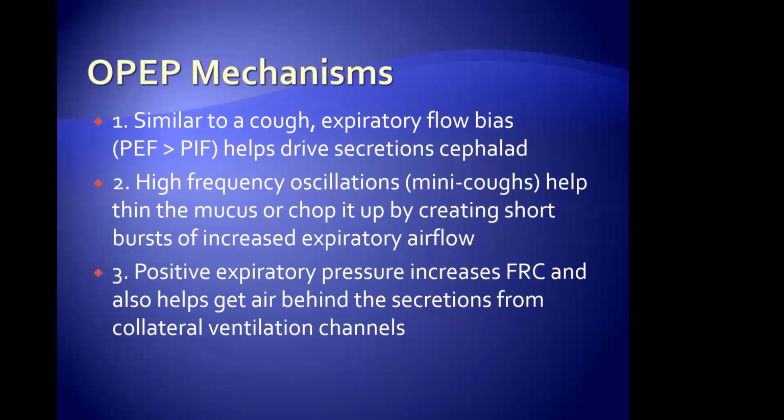Just as we looked at that waveform, and just as we looked at the screen that showed the alveoli, the pressure going through, the volume going through, the collateral channels ventilation, it's happening. Now, again, years ago when you took your boards, you had to know that stuff. Now, every day, we're just out there, okay, let me do this neb, let me do this. You may not be visualizing that, but I'm going to ask you right now, as you move forward, take a minute with each patient that you have the privilege to serve and think about what is going on dynamically with that patient. We're not just a bunch of neb jockeys.